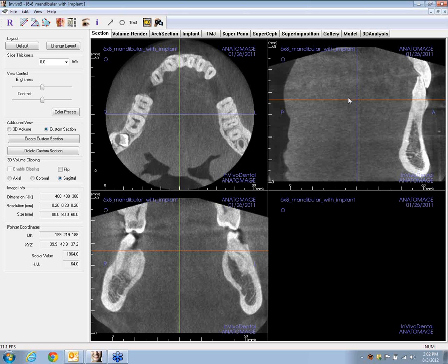This is in conjunction with the next session, which is going to be offered on August 14th regarding the implant library and preferences customization. These two programs are going to teach you how to manage your inventory of implants, make it simple to plan your cases, and make your workflow as streamlined and as efficient as possible. We'll get started right away.